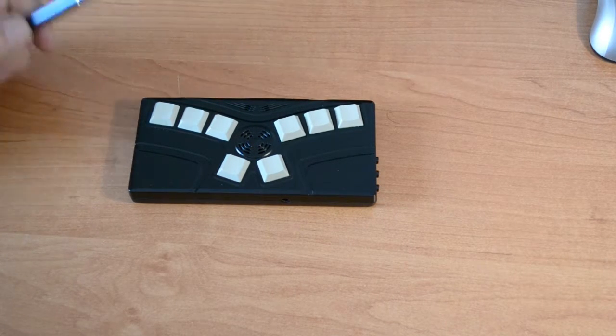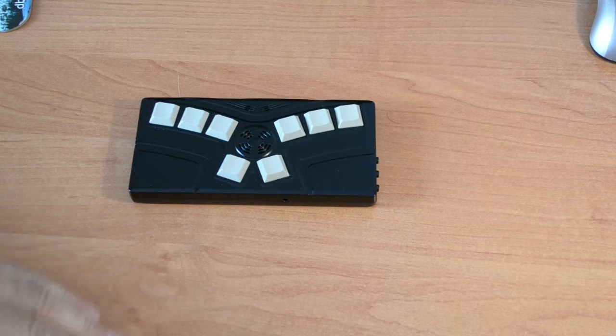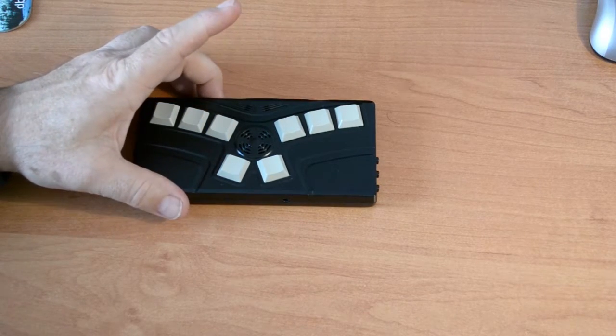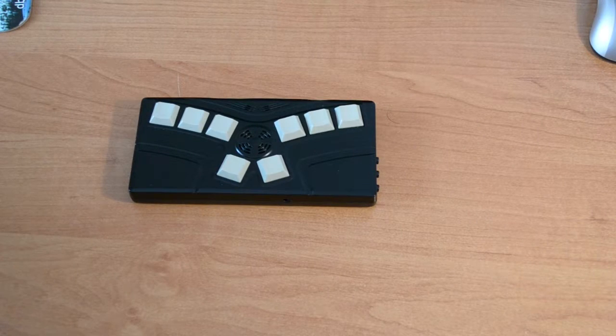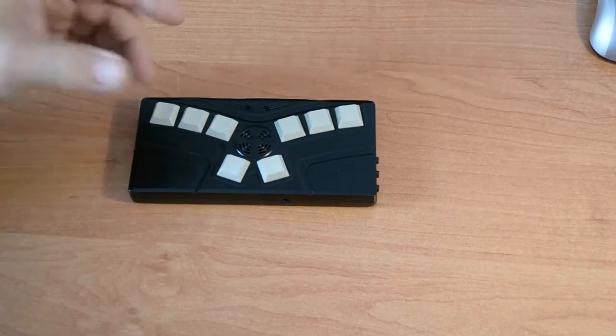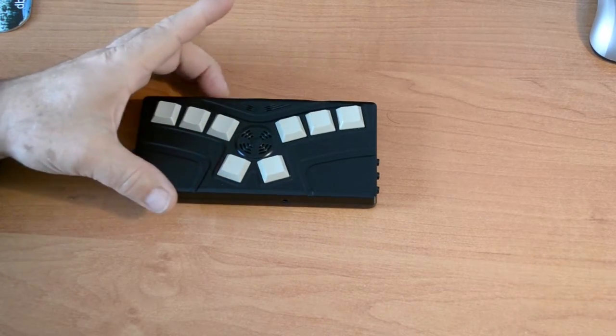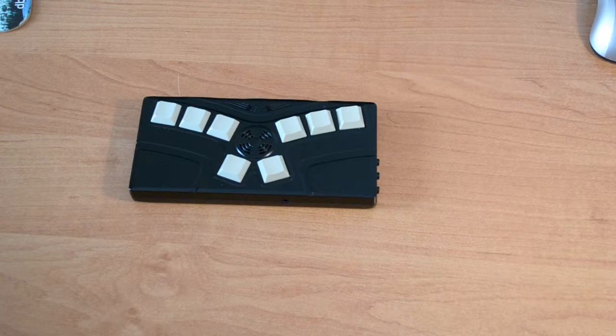IBAI ready. The device was switched off totally, so the time for getting ready was several seconds. But when we switch it off to sleeping mode, we get the message "bye", and now we can switch it on very fast. So during our work day, we don't have to switch it off totally. We can only go to sleep mode. To get back, it takes less than half a second. Okay. The device is ready to work.